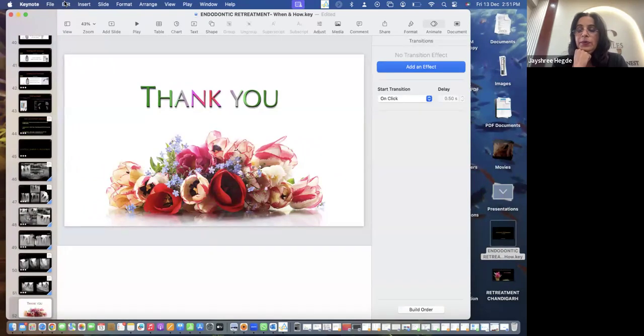Yes, you can remove, because we are not going to remove it all the way till the apex. Size 20, I wouldn't recommend. It's always better for you to enlarge it more than that. Even if you use a high flex remover in a 20, don't worry that it's going to be larger. 20 is not a size for you to obturate, but yes, high flex remover will remove from both 20 and 25 size obturated canals.